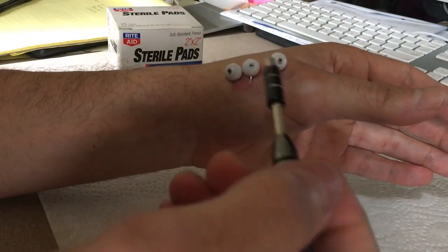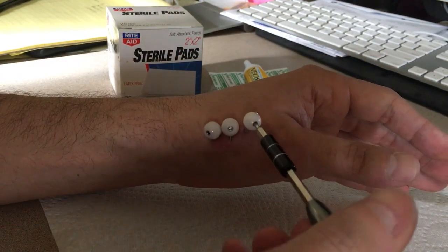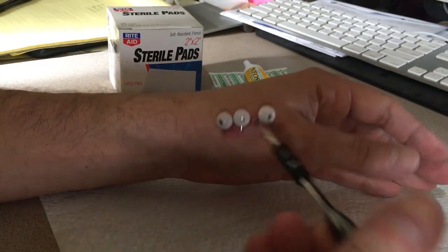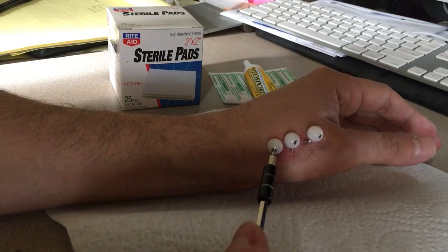You can see there's little hex keys holding the little white balls on the pin. It looks like this first one is already really loose so it should come out fairly easy, but I still want to try to take off the little white ball on all of them.